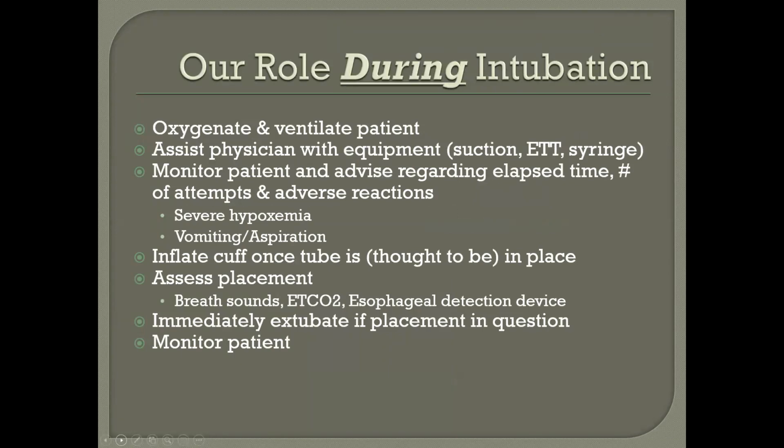During the intubation, again, oxygenating the patient, ventilating the patient, or ensuring that's done. When we actually intubate, I don't really like to get too tied up in bagging the patient too long and tiring out your hands, and just a distraction, but making sure that it's adequately done, assisting with it, etc. Assisting the physician with the equipment. So the physician's doing the actual intubation, the suction, various ET tube sizes, the syringe, the end-tidal device, monitoring the patient for any adverse issues regarding elapsed time, number of attempts, adverse reactions.